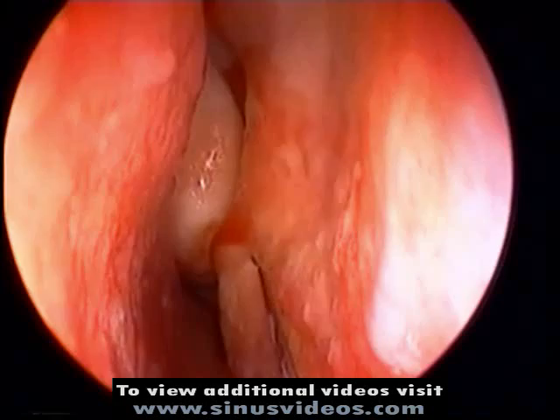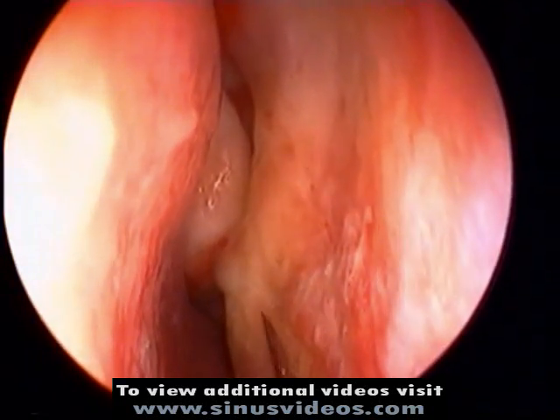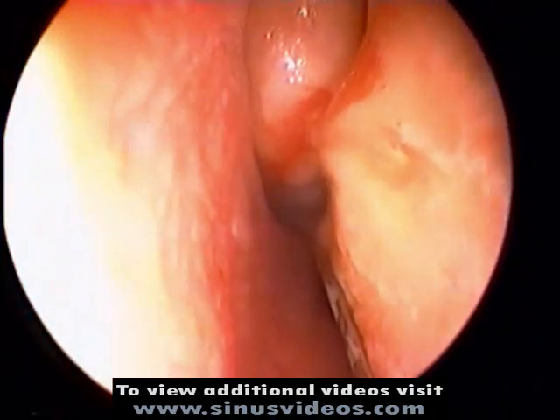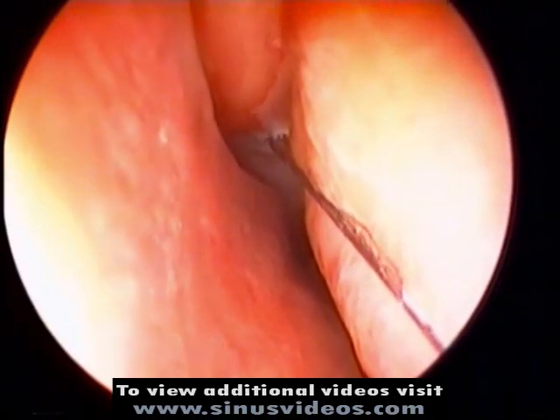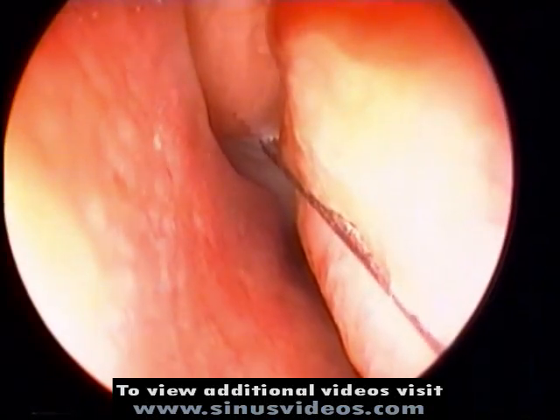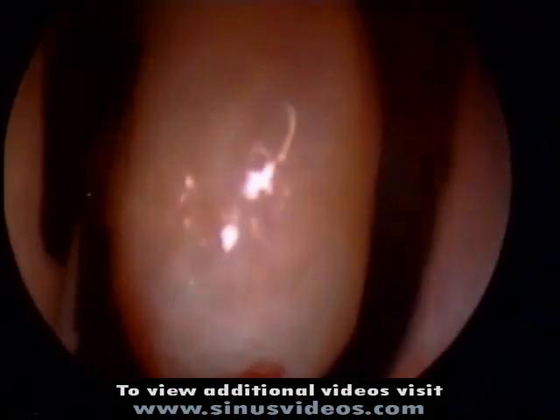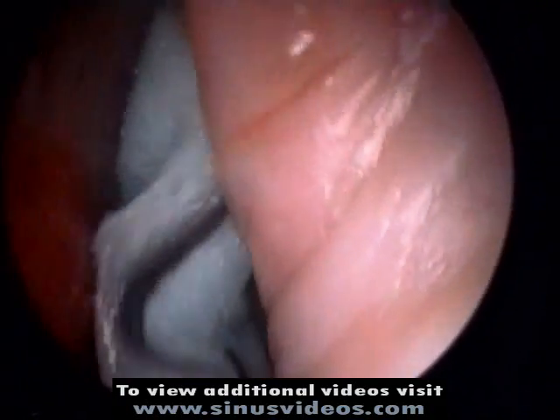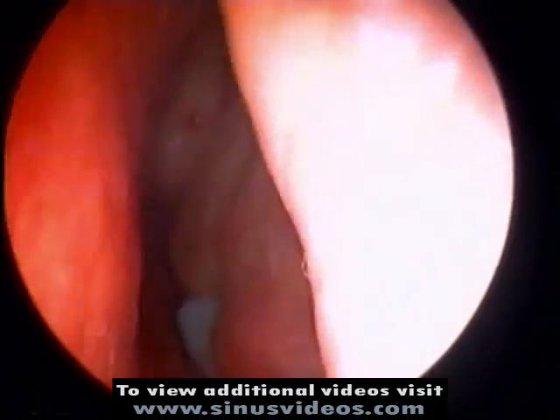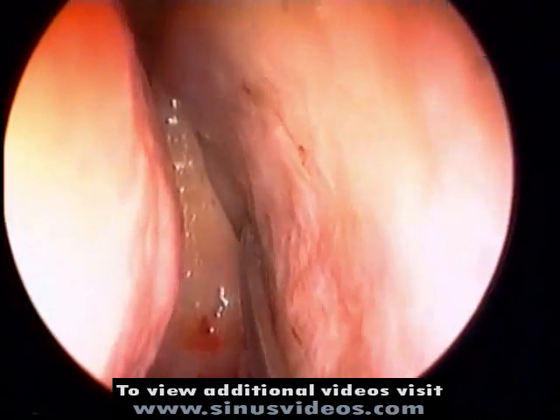Injections are also placed in the anterior aspect of the middle turbinate. An injection inferiorly along the lateral nasal wall is placed in the root of the inferior turbinate. Supplemental injection can be placed along the posterior aspect of the middle turbinate. This injection infiltrates posteriorly towards the sphenopalatine region. An additional injection is placed here in the posterior aspect of the septum, also anticipating inspection of the sphenoid region with enlargement of the sphenoid ostium.